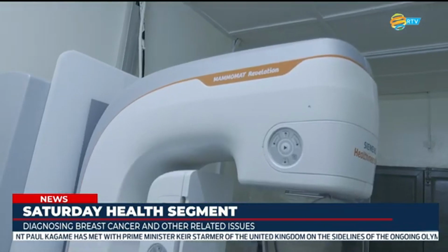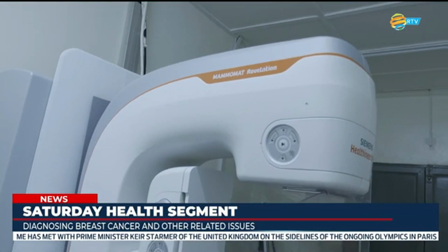Then for biopsy, after the second one, the diagnosis, if we find that there is some lesion, it is now a candidate for biopsy. So biopsy can be used in case of calcification, because those are friendly lesions for the X-ray.